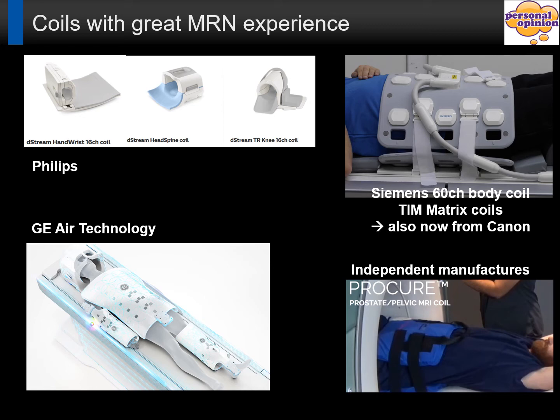Let's talk a little bit about coils, because it's not a secret that the best coil will give you the best signal. However, there are new developments. For example, dedicated multi-channel coils. Of course, they have been on the market for quite some time, but there are also dedicated coils which you can basically wrap around the patient these days, so that you have the coil really close to the anatomic region of interest.